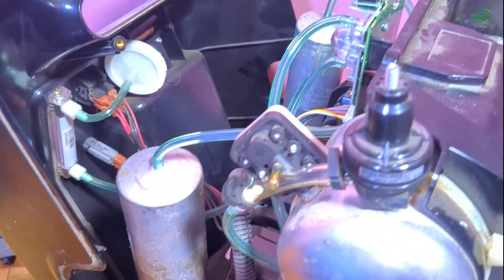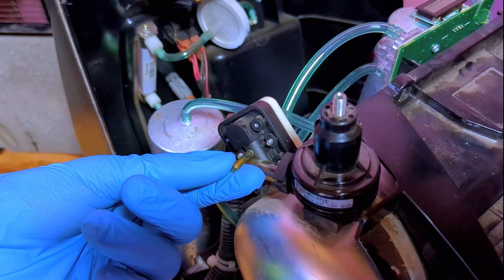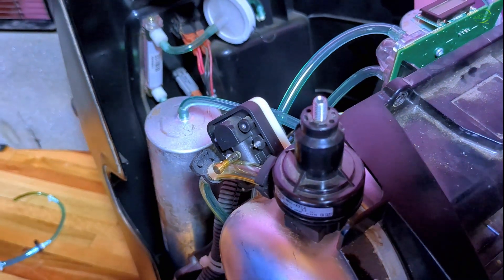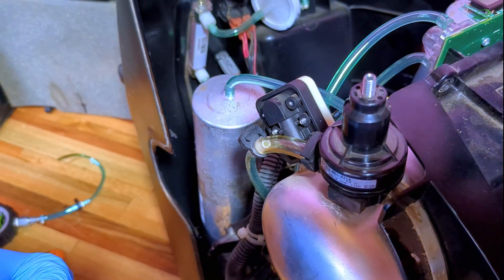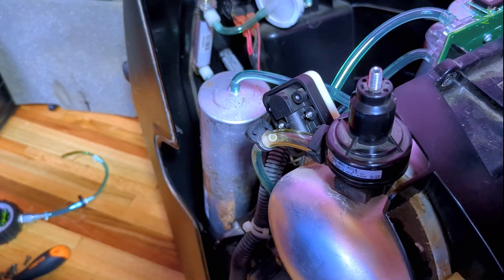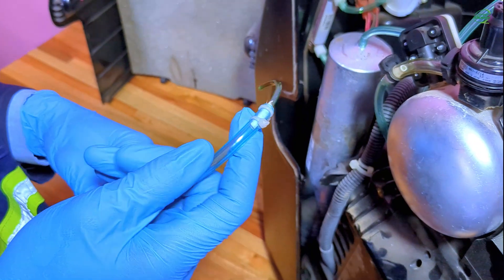For other models, this test point is located on a TFT. The test point is covered with a tubing cap, so before starting the test, you have to remove the tubing cap. Now I am going to remove the tubing cap. And then I will connect the tubing from the pressure gauge to the test point.